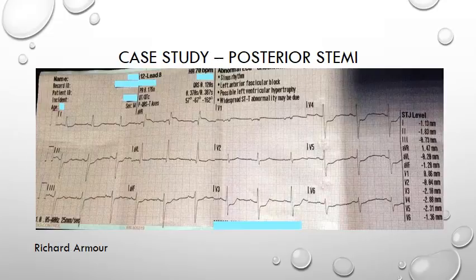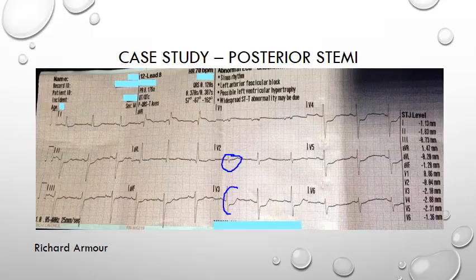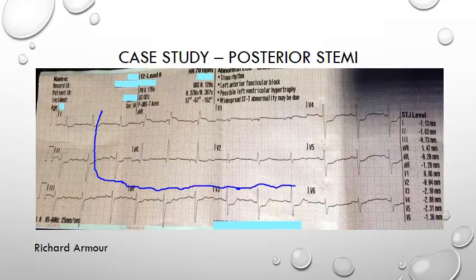Our third ECG was submitted by Richard for a patient in their early 90s with upper back pain radiating into their shoulders. There is ST depression in leads V2 and V3 with a tall R wave, which would make us suspicious. However, looking elsewhere on this ECG there is widespread ST depression seen from the high lateral leads through the inferior leads and up to the left-sided chest leads as well. This is more suggestive of ischemia — most likely sub-endocardial ischemia.